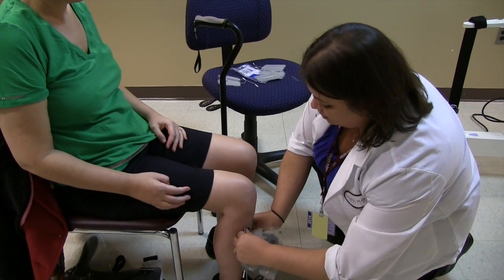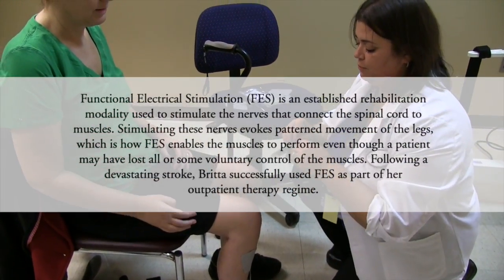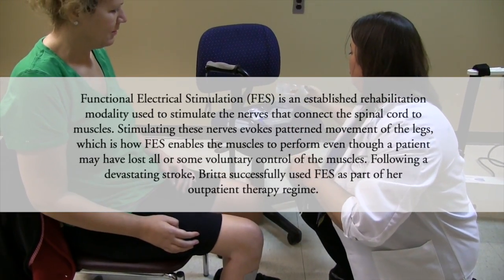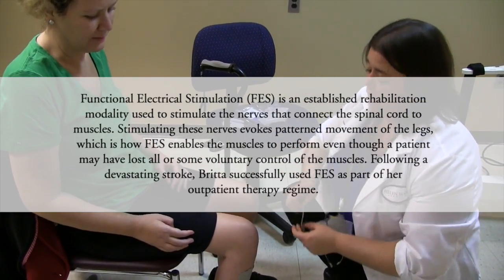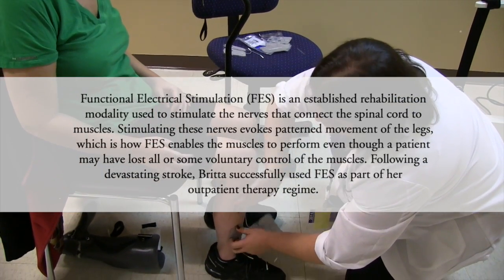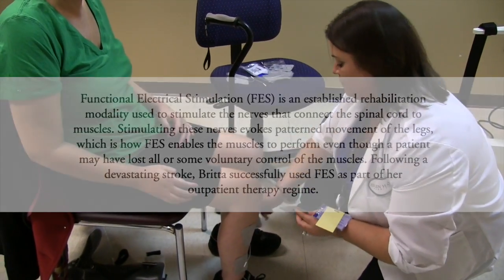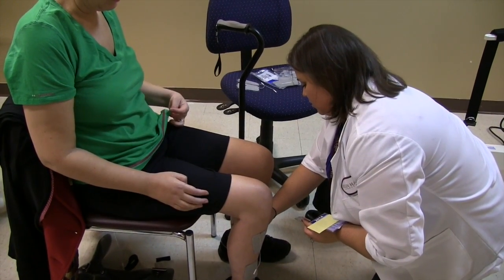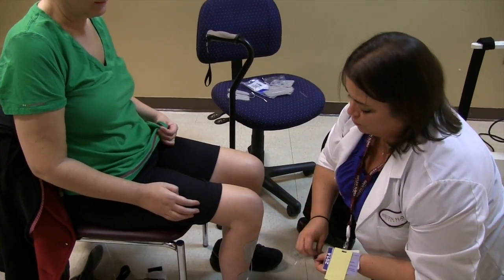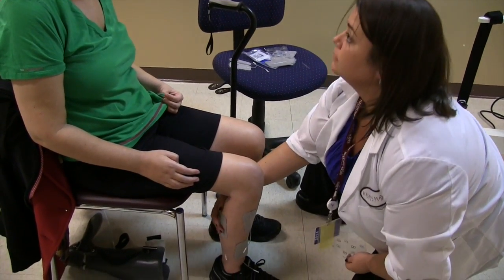We're going to have the electrodes on all five of your major muscle groups in your leg so that it can provide stimulation for them. The major muscle group down there is the anterior tibialis — it helps to dorsiflex your foot, bringing your foot up off the ground. This is your gastroc, so you can push off through your toes when you're walking, otherwise known as the calf.